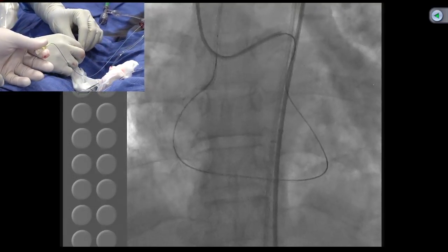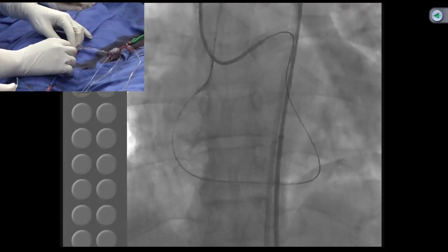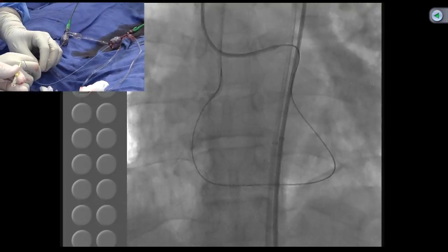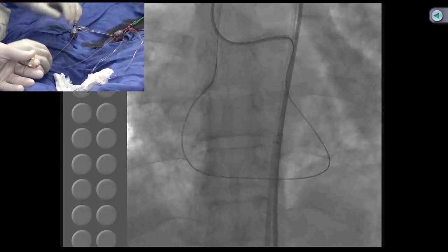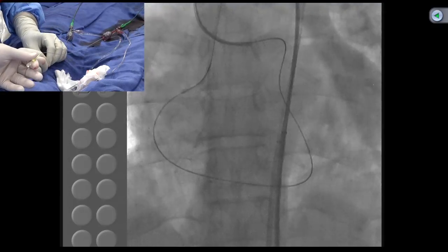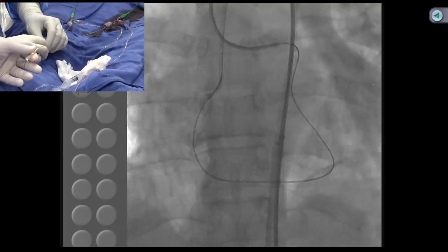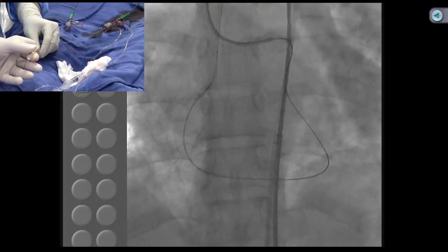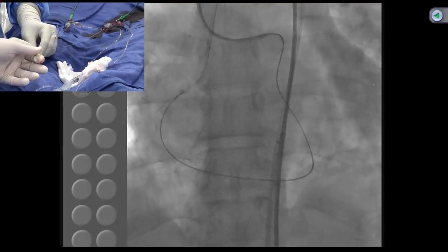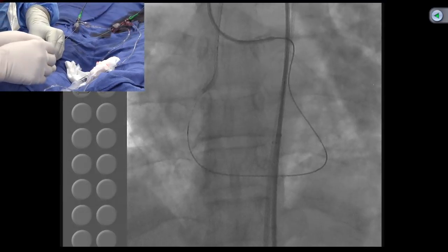So I'm coming back, and this is another thing here. See, it starts getting sucked in. Pulling back the Corsair out. And this is a very important step. This is where your left guide will suck in, or your donor guide will suck in, whether right or left. So I'm taking it out. Now you can advance the fine cross a little bit.